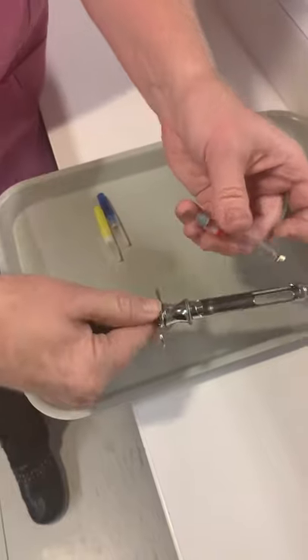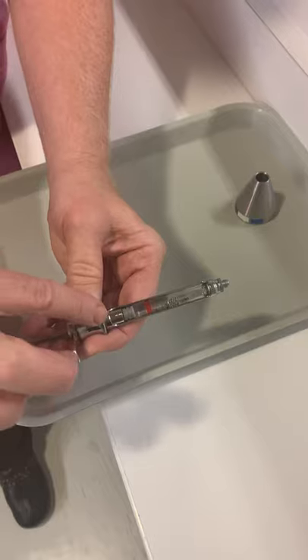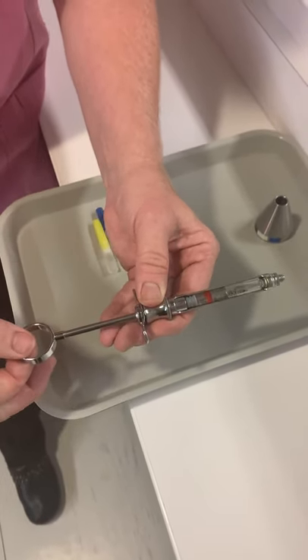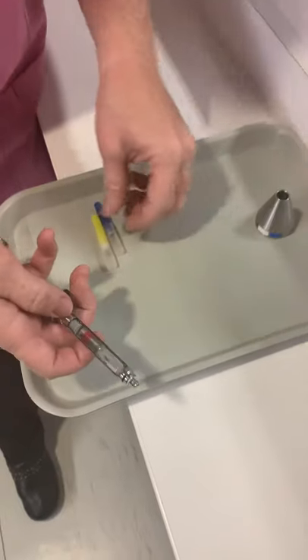Once the carpule is in, we want to make sure we engage the harpoon into the plunger. Push a little bit and then pull back to make sure that it's engaged.